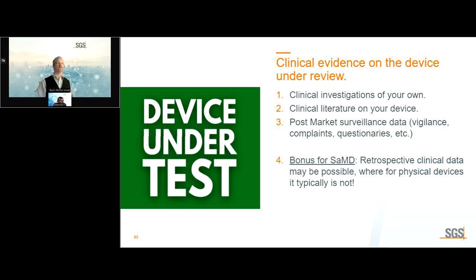Does that data have to come from real-time clinical investigation, or can you go to a database of redacted patient data and do a retrospective clinical data analysis? It is possible that you can. That's something that physical devices broadly can't do because software is agnostic to where the data is coming from. It doesn't understand in its I/O whether that's a real patient hooked up to it or not.